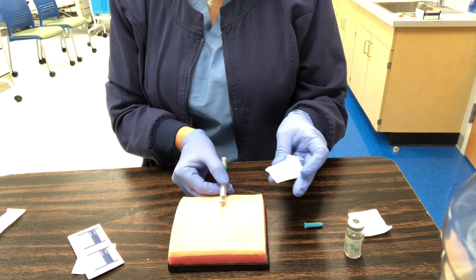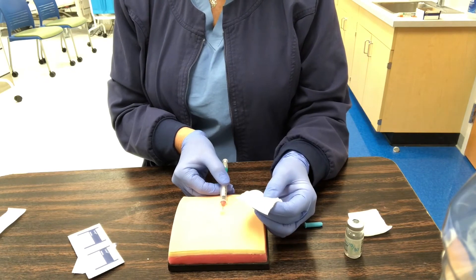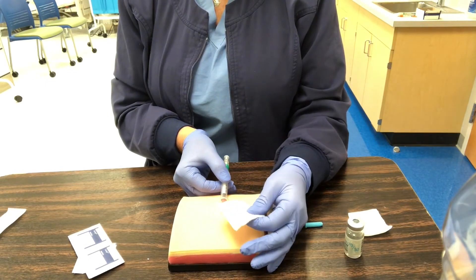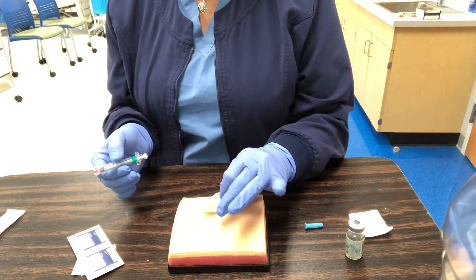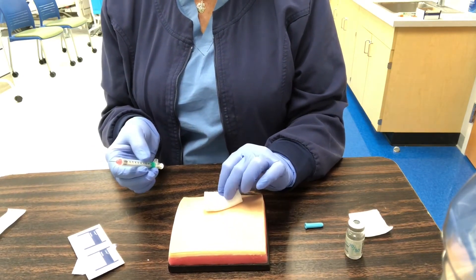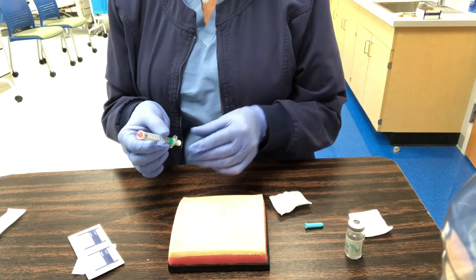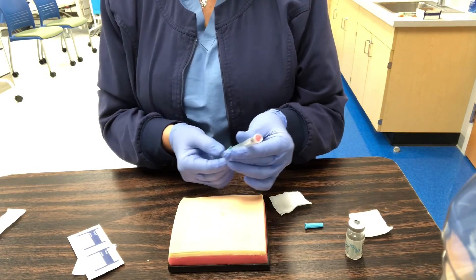I then let the skin go, let that sit, and pull out my needle. I will not push the bleb — I don't want to push the bubble back into the skin because that is what I want. I just make sure no blood or fluid comes. It looks good. This syringe actually has a guard — you pull the base and it goes up.